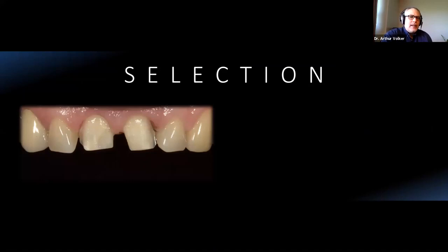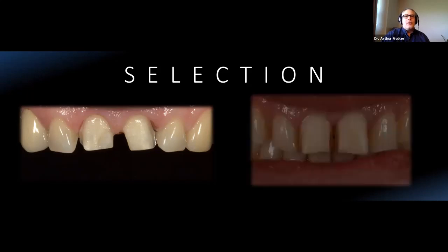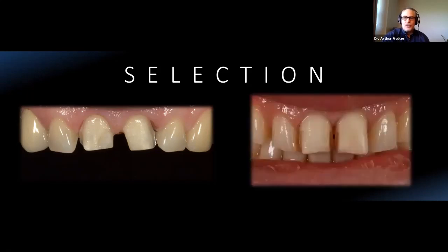And I want you to take a look here. Look at the adjacent teeth, and you would say, hey, that's pretty close. Why don't we take some of the color from the existing tooth and we can use that to enhance our aesthetic outcome, right? Hold on, because I want to just show you one difference between the preparation for this case and the preparation for the last case.